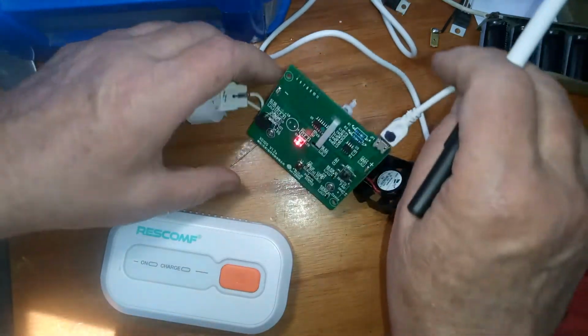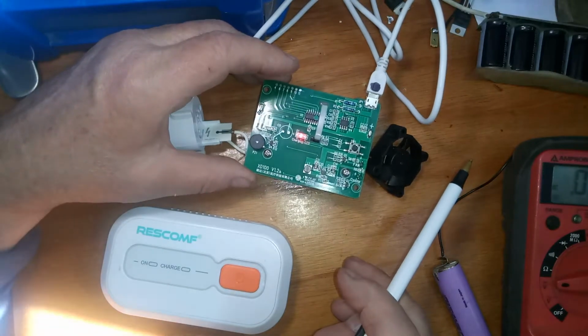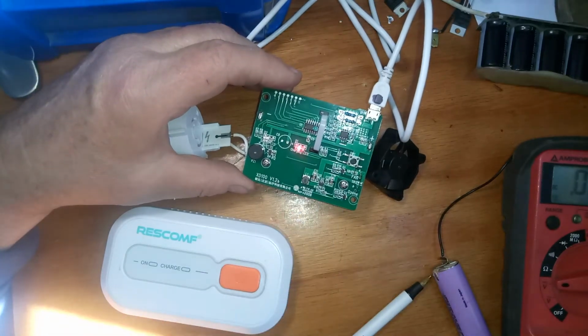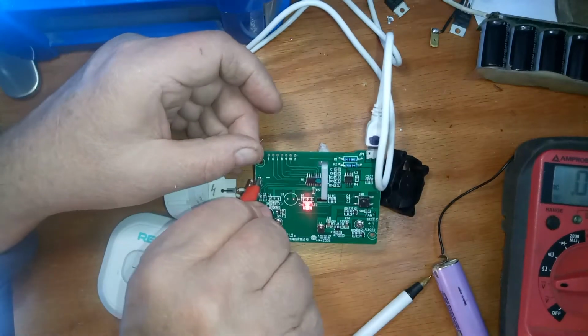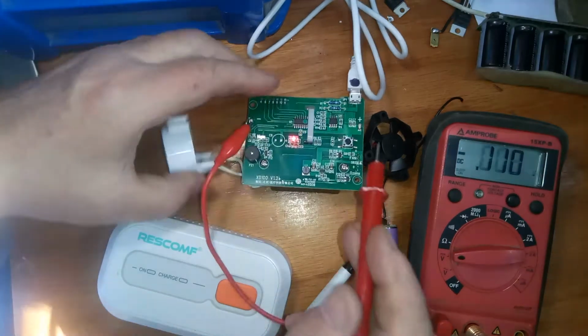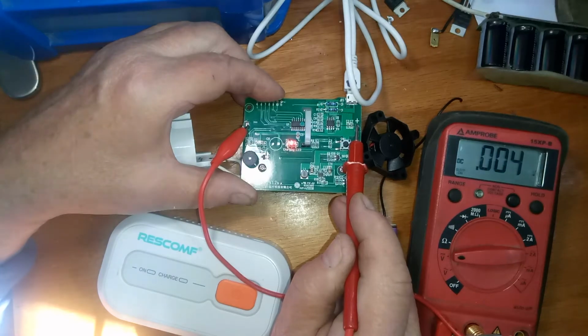I was kind of surprised. I thought maybe a wire had fallen off the battery or something like that, and it would be an easy fix. But I got in here, and let's show you what I found. Here's the minus side. Remember, it's on charge right now. And all we can get is 0.004 volts.